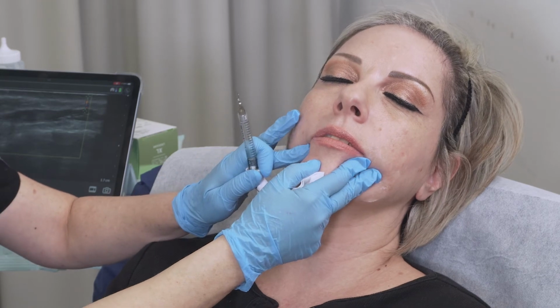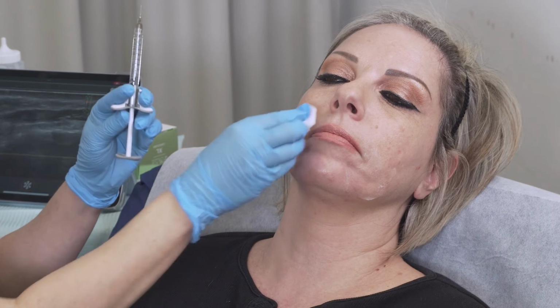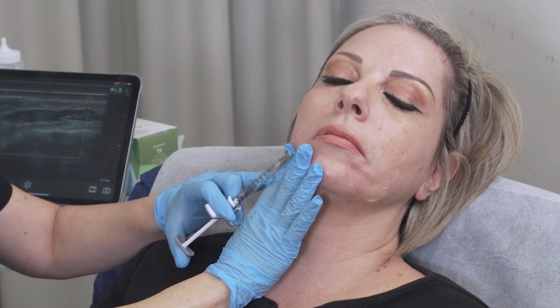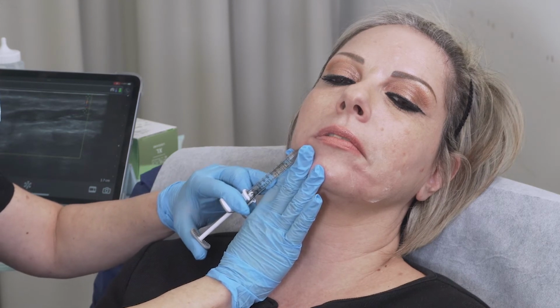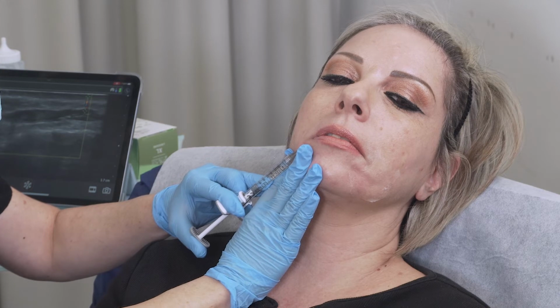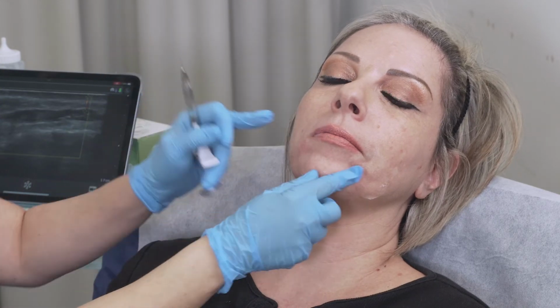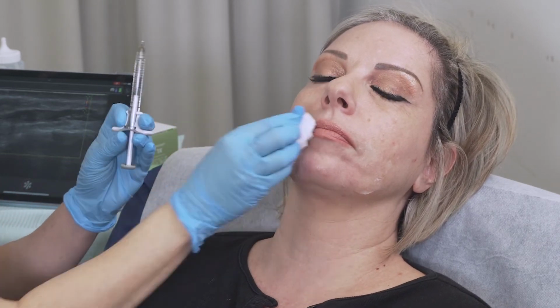And also the vessel was lateral to where I'm injecting, so it was deeper and lateral to the area of where I'm injecting at this moment. And so this is for this side, and it's done.